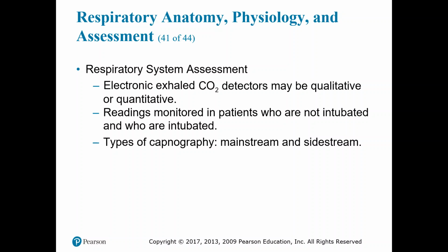Okay, as we continue talking about end-tidal CO2, our electronic exhaled CO2 detectors may be qualitative and/or quantitative. Qualitative means they're going to give us a yes or no answer: either yes, there is CO2 present, or no, there is not. Quantitative is going to give us a number associated with that. Yes, it's going to tell us if CO2 is present, but it is also going to give us the number that we are looking for.